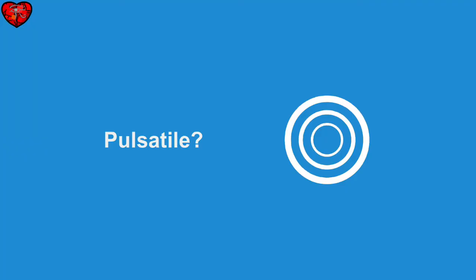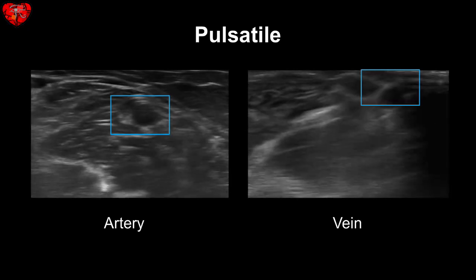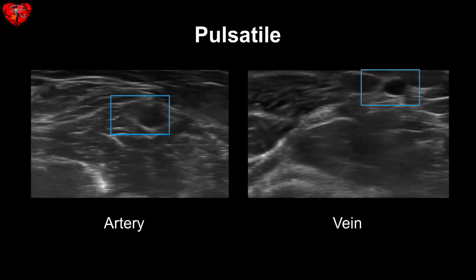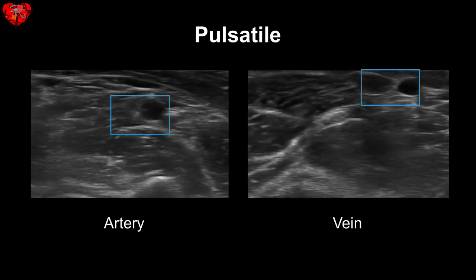Another way to tell the difference between artery and vein is seeing if it's pulsatile or not. An artery should have a pulse with it, whereas a vein should not necessarily be pulsatile.